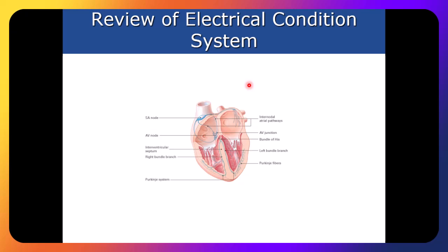Potentially, yeah, you're exactly right. It is potential because of the speed of the conduction, and remember, it's coming from the junction. The junction is part of the conduction system, so it's right there on that track. So, Abe, what you said about the ventricles firing first is a distinct possibility. And again, this is why we may see the QRS and then the P wave afterwards. But it's not going to have any impact on our ventricles.